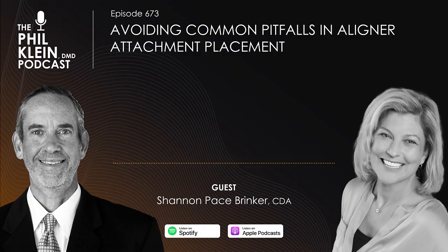Next, we're going to fill our attachment template with the composite. Michael Miller taught me a long, long time ago that, Shannon, you never mix manufacturers. They're always made to go together. And I see this a lot where they're using one type of bonding agent, another brand, another system, and then they're using a different composite. And I think we just have to remember, and really, he just beat me up with this: you don't mix manufacturers. I think this is the problem in dentistry: everybody thinks they're all the same, and they're not. They're made to go together, and that to me speaks volumes, and it stuck with me. And he's absolutely right.